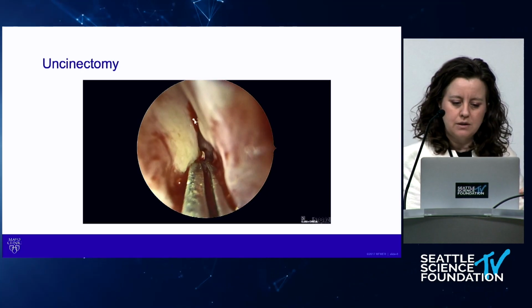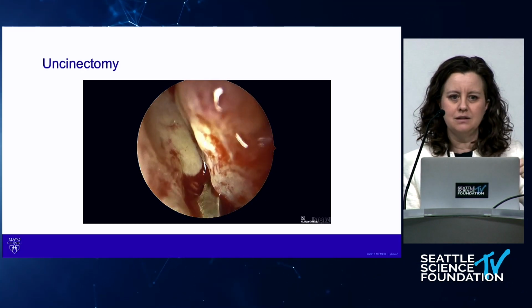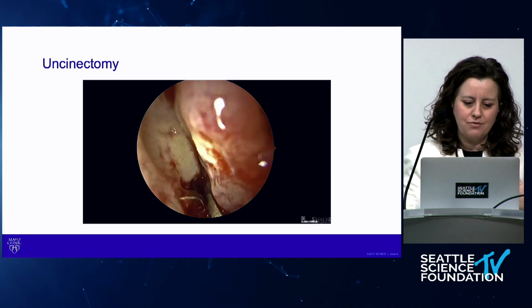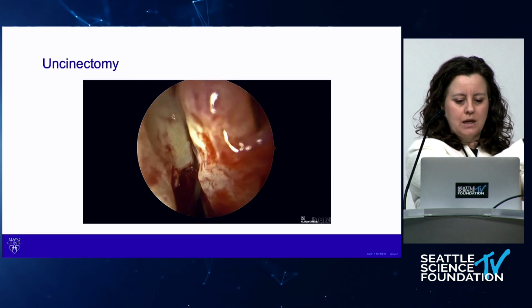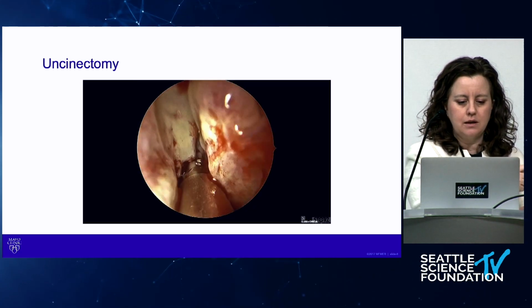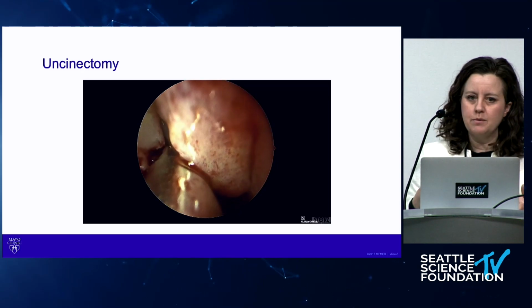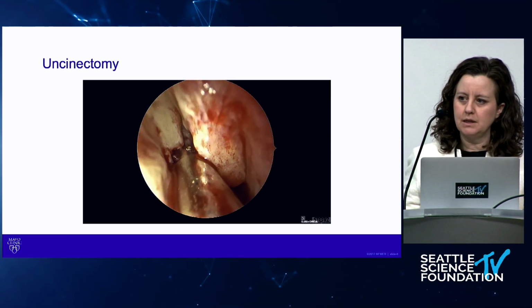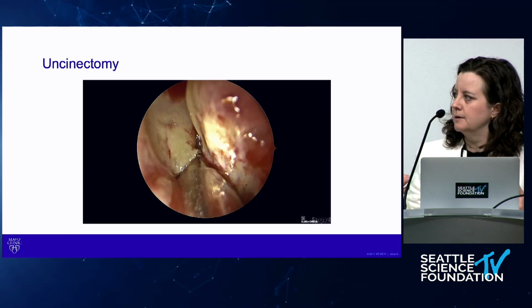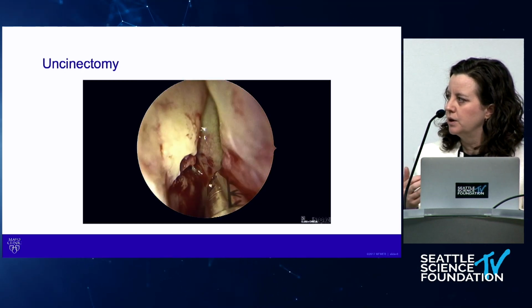Some people use a sickle knife. I'm not really a fan with trainees of using a knife to cut the uncinate towards the eyeball. I'm always working away from the eye. And so we make this cut in the corner here. You can continue that cut superiorly if you want. I love the microdebrider. I could do basically an entire sinus surgery with just a microdebrider. And so I'm going to show you lots of microdebriding here.